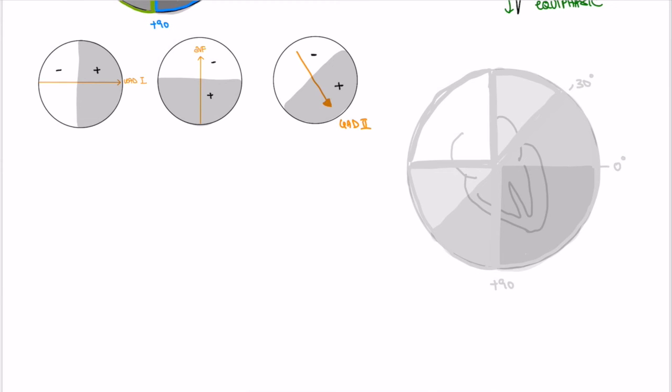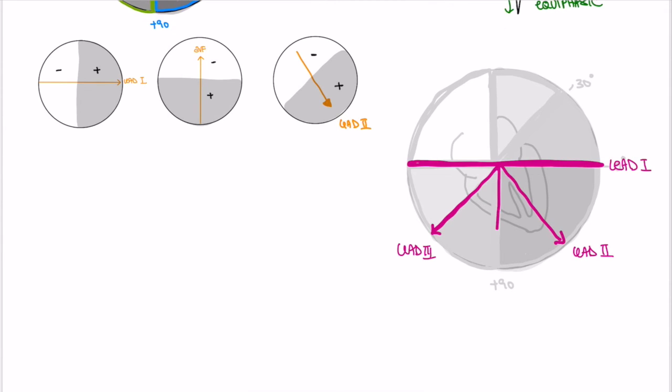Let's map the frontal leads out to have a better understanding. The bipolar leads are mapped out with the lead 1 going horizontally, lead 2 and lead 3 with an inferior view. The unipolar leads have AVF going vertically, AVL and AVR coming in from either sides. These limb leads are present in the coordinate system and facilitate ECG interpretation. So how do we use this?